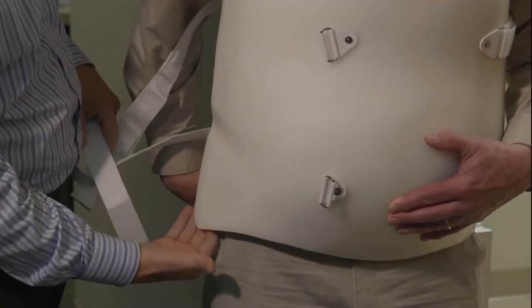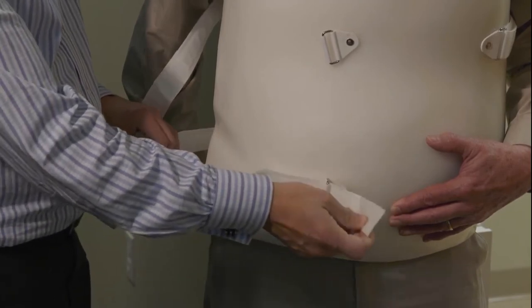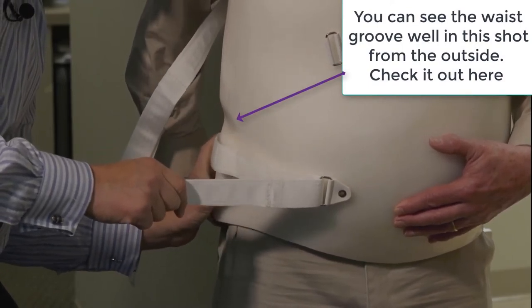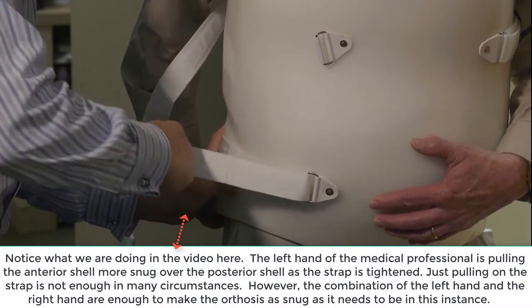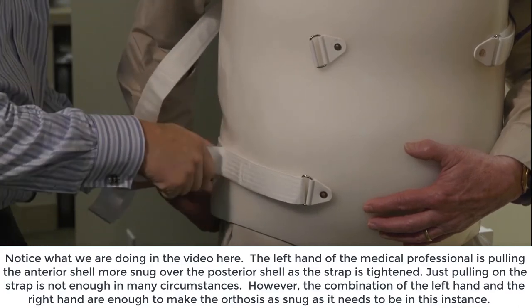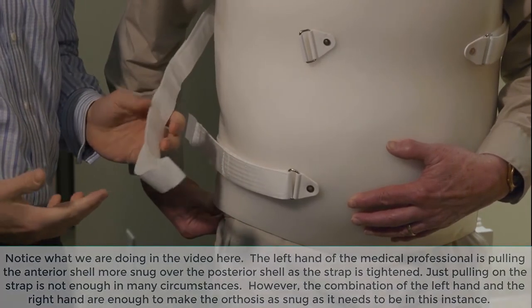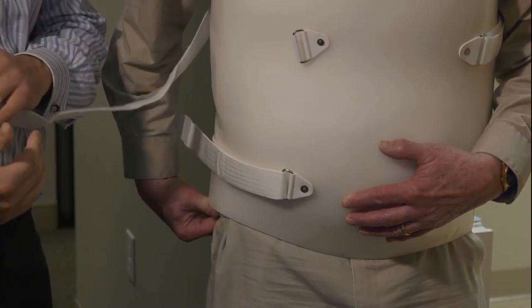The brace isn't on a hundred percent yet — you can see there's space involved. We're going to do the distal strap on the patient's right-hand side. What I tell patients to do is pull the two pieces of plastic together if they can, or if someone's helping them, that's great. If you can pull the pieces together and then pull the strap at the same time, it helps to cinch it down. It's not like a shoe where you can just yank on the strap. These braces are all meant for motion control — if you want a brace to be doing its job, it has to have motion control. A loose brace does not reach that end.